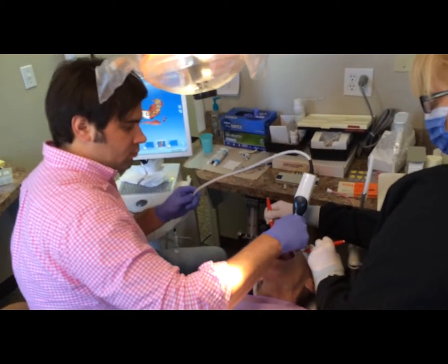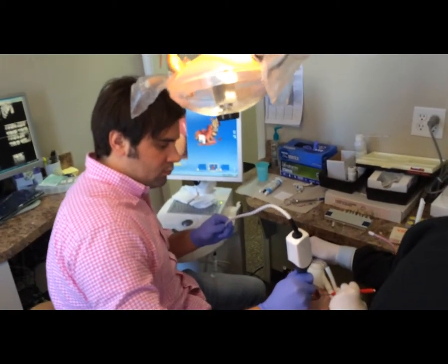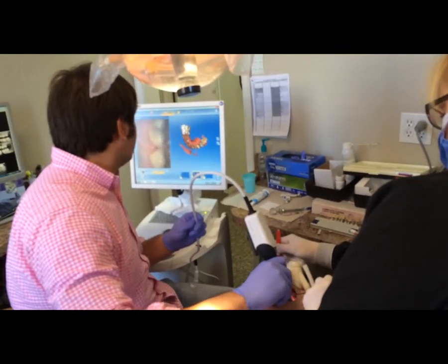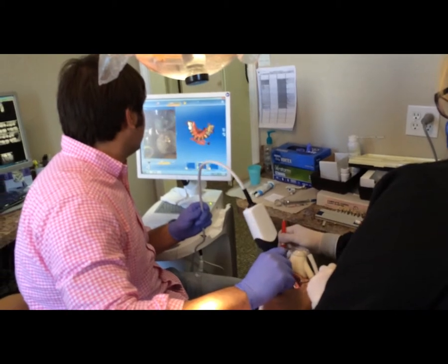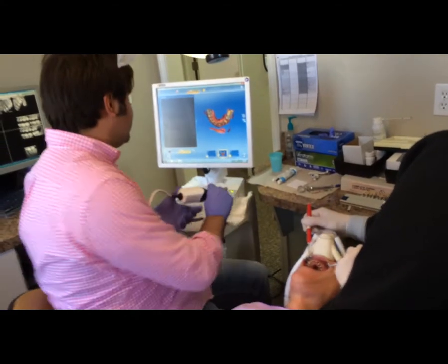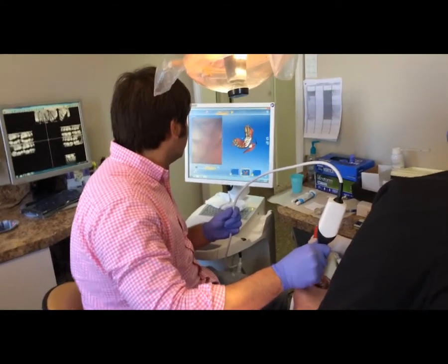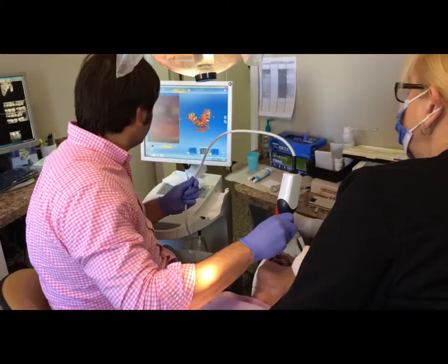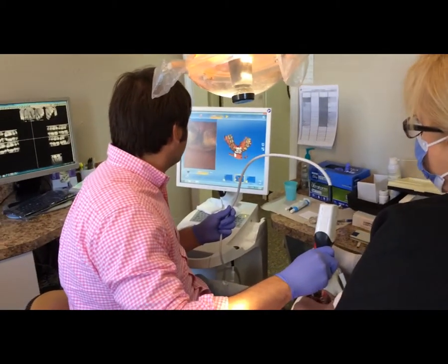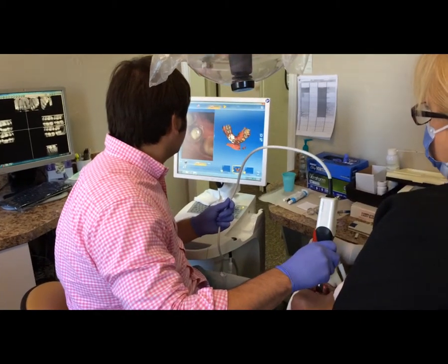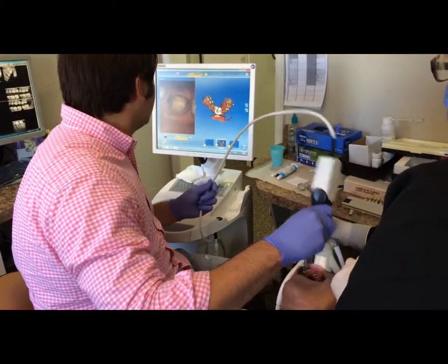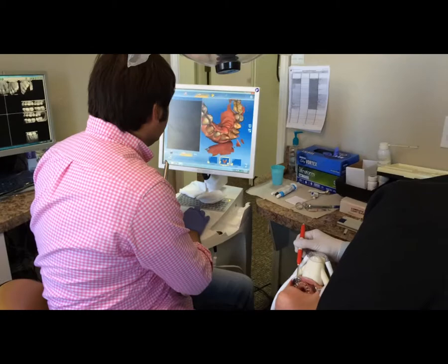Here we notice the technician finding his location in the patient's mouth to have a good starting point for acquiring the proper information. We can see him rolling the wand and looking back at the screen to see where he is scanning. He pulls out, repositions, and continues checking the screen as he goes to make sure he gets the correct information for the anterior 6 case. He checks interproximal contacts, verifies the information is correct, and moves the wand to different angles to fulfill the scan and produce the proper digital impression to submit to the lab.